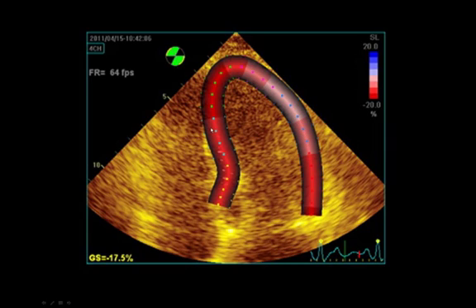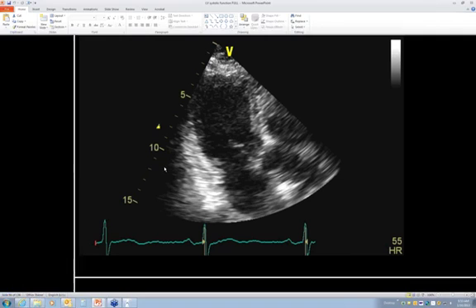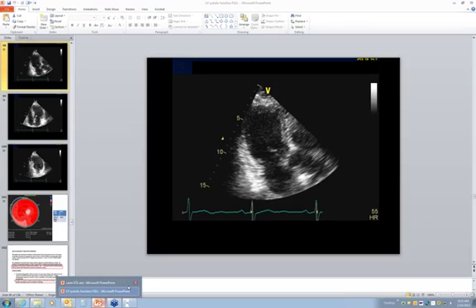The Philips, my next slide, the Philips uses a system called a mesh. And so they have these diamonds or these rhomboids across. And so what they do is that they track at the intersection of the lines, they track these little dots.